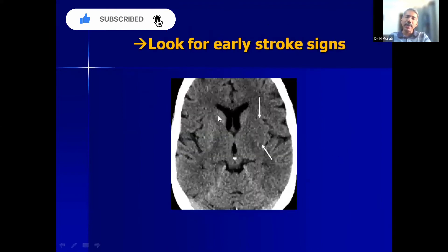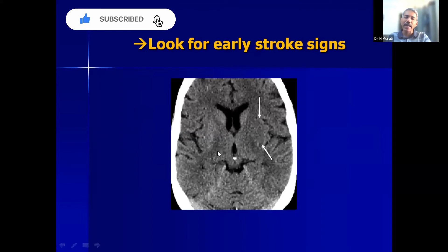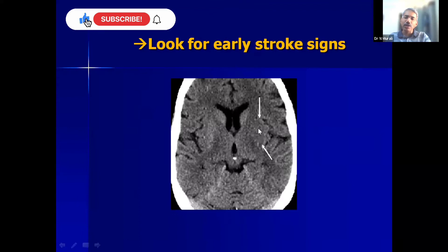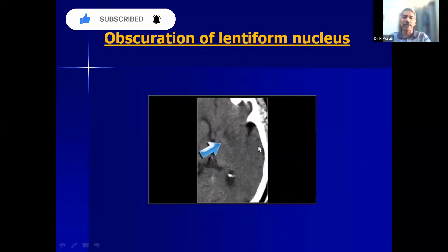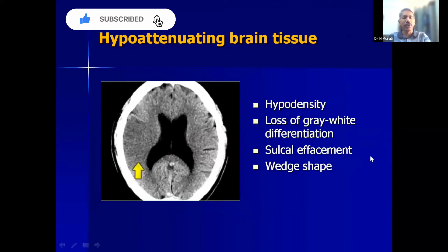The part of the brain where the Sylvian fissure subtends is called the insula. When the insula alone becomes hypodense — since edema reduces Hounsfield values making tissue appear dark — this is the insular ribbon sign. It looks like a ribbon. In one patient you see normal gray matter, but in another patient it is clearly darker — that is the insular ribbon sign indicating early ischemic change.